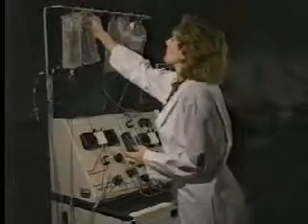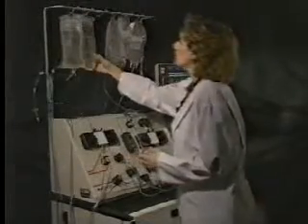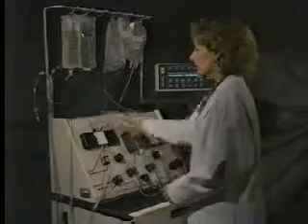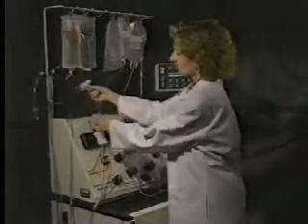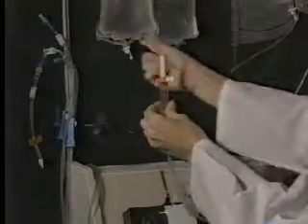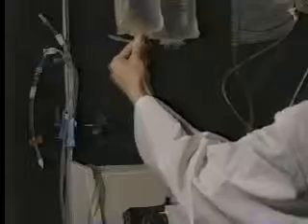For patient and donor safety, be sure not to confuse the connection of the AC and saline lines. Follow the AC line from the top of the AC pump and make sure you connect it to the AC bag. Remember to use aseptic technique throughout this procedure. Connect the AC line to the anticoagulant container.